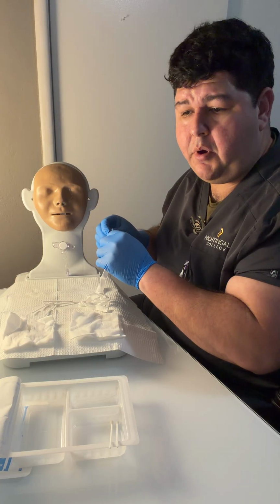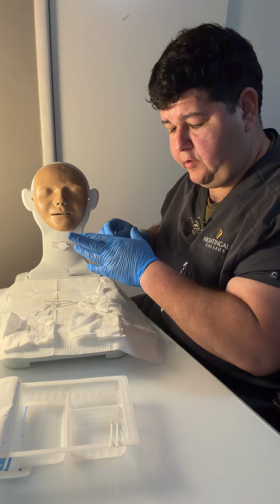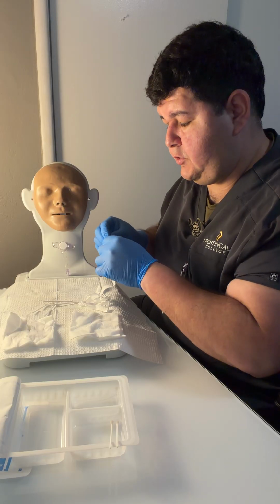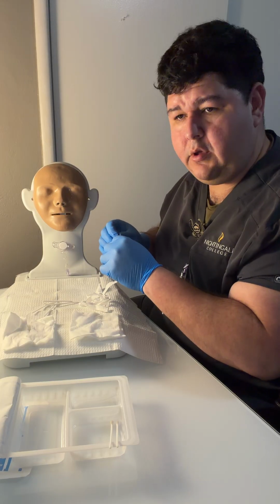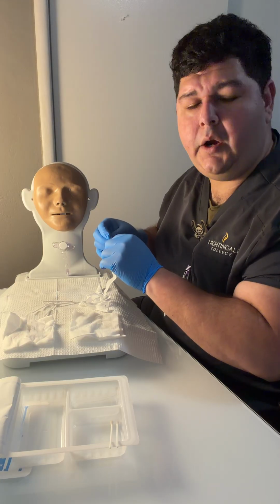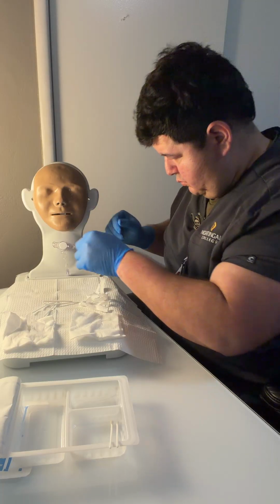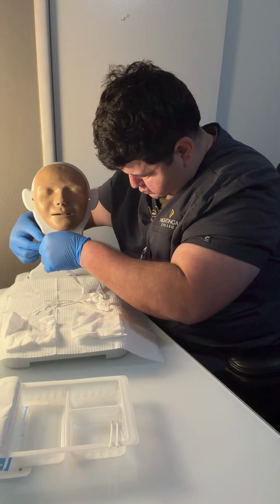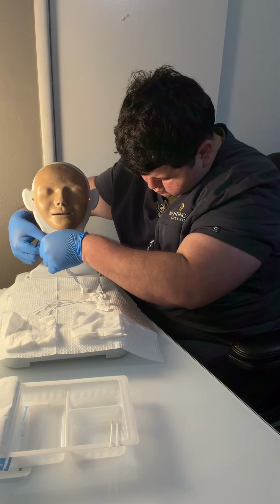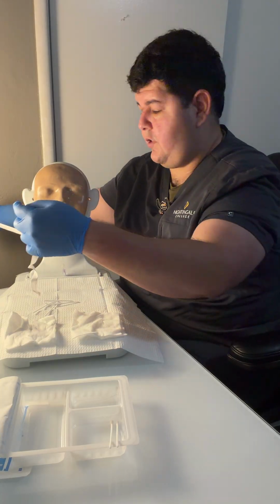However, if I am by myself, the idea is that I don't let go of the trach. For the video purposes, I'm assuming I have 2 people, just so that I can work the tie, because the tie that the kit came with was taped to the back and required 2 hands to free. Additionally, this kit only came with the 1.